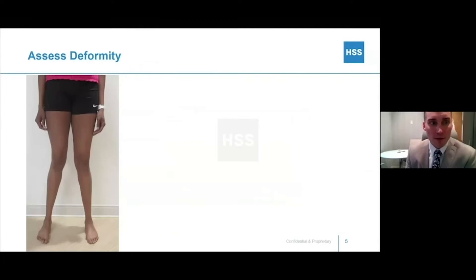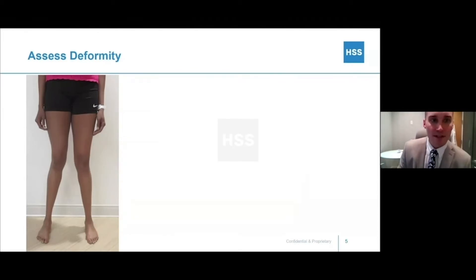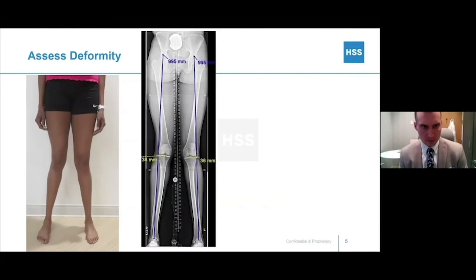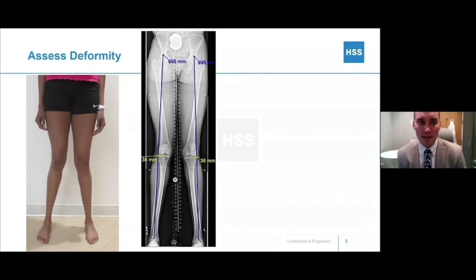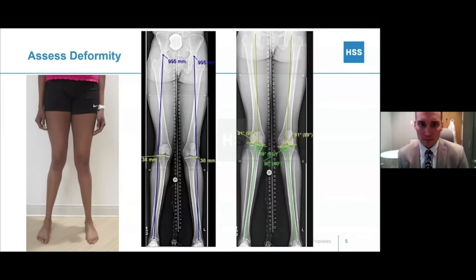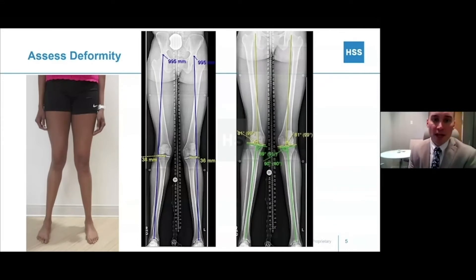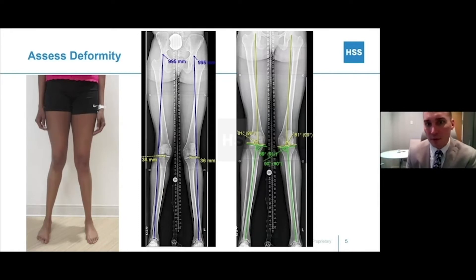We want to assess our deformities. That starts with the patient standing — you can see this patient has a valgus deformity of her knees. We obtain standing radiographs and start to measure our lines. This is a mechanical axis line through the lower extremity. You can see it is lateral to the center of her knee, and we measure the magnitude of that deformity. Then we measure those joint orientation angles to identify where we think the deformity is coming from.